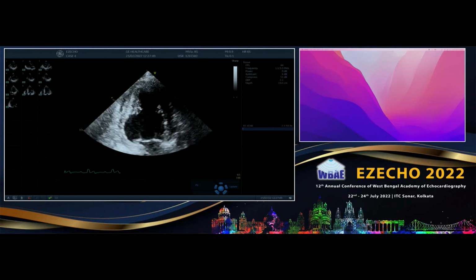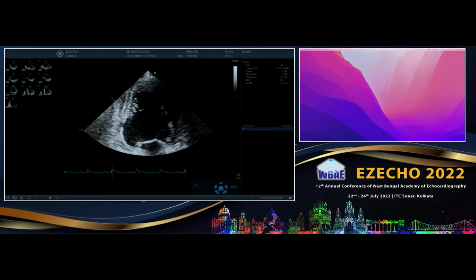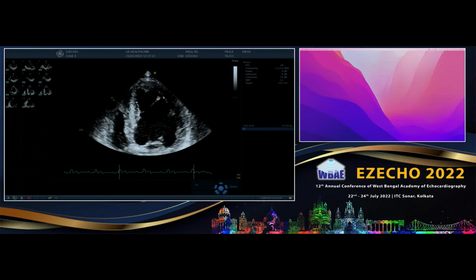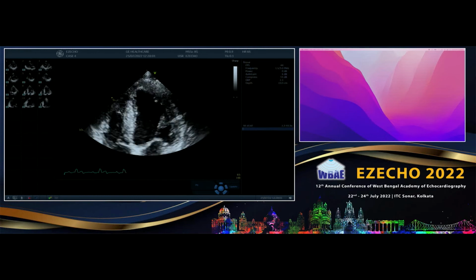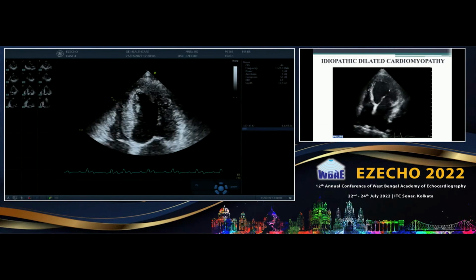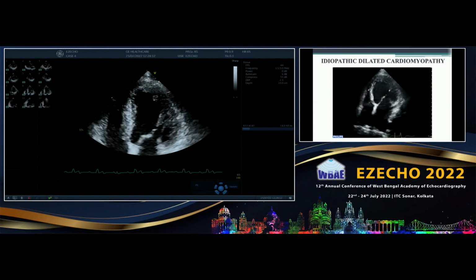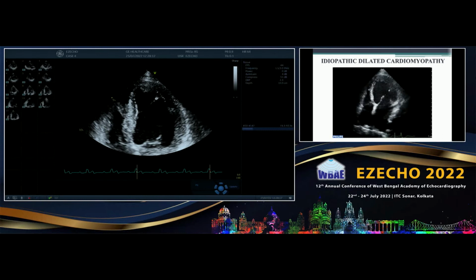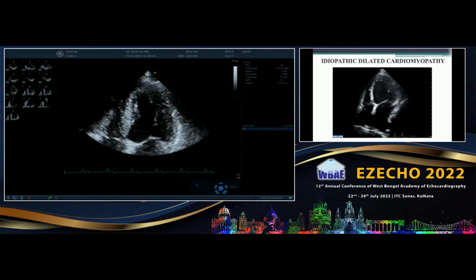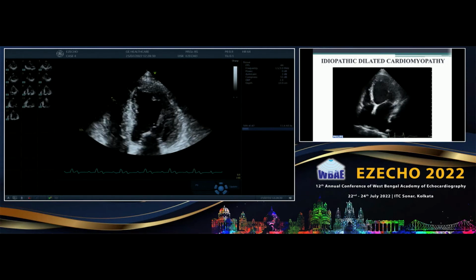Now, what we will do is always describe the regional wall motion as per the 16 segments and not the way you want it, correct? 16 segments. So when we are in the 4-chamber view, we know that these are the basal segments, these are the mid segments, and these are the apical segments. So when you are describing a lateral wall, you will be calling, say, the middle and basal, or middle and apical lateral wall, or we are describing this as an inferior septum: the basal inferior septum, mid inferior septum, apical inferior septum. Second thing, now this is very basic for the beginners, is that only in the 4-chamber view have you got all the 3 coronary territories supply.